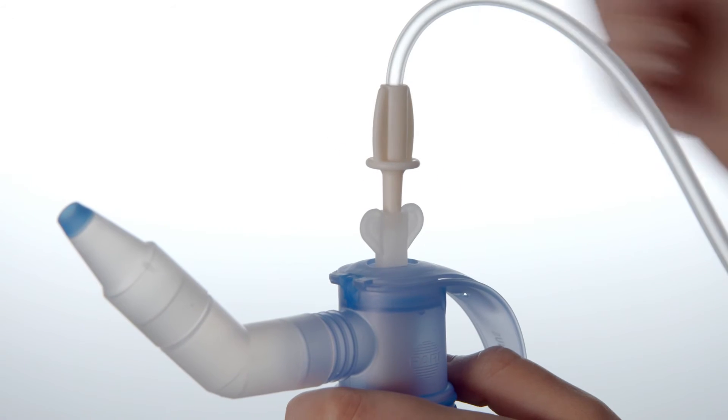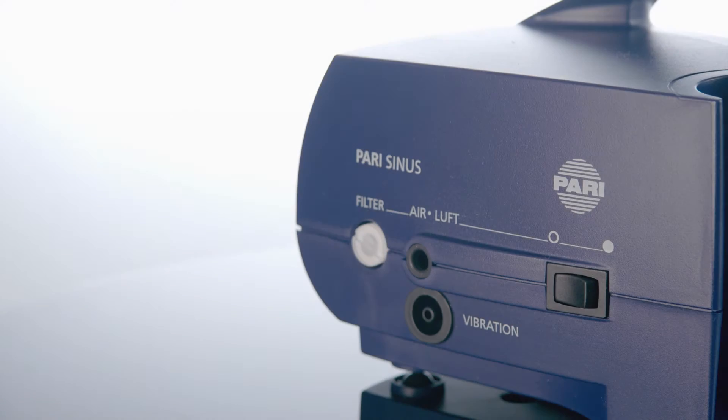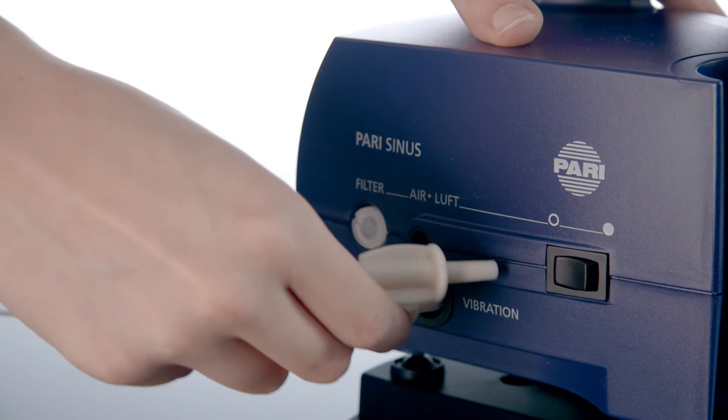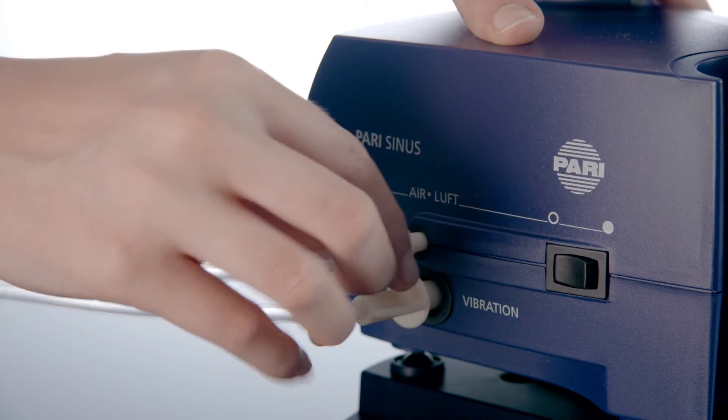The free ends of both tubes should now be inserted into the compressor device. It's not possible to confuse the tubes; the tubes will only fit into the sockets for which they are intended.